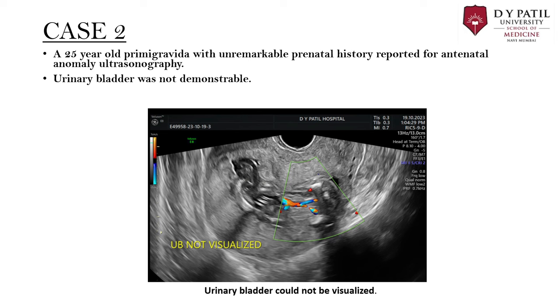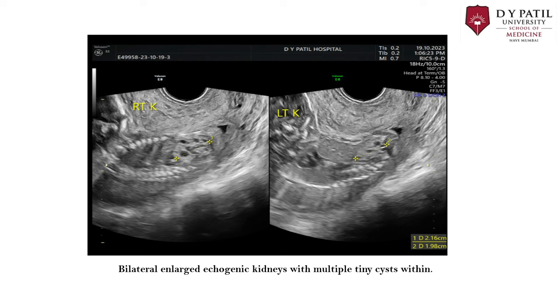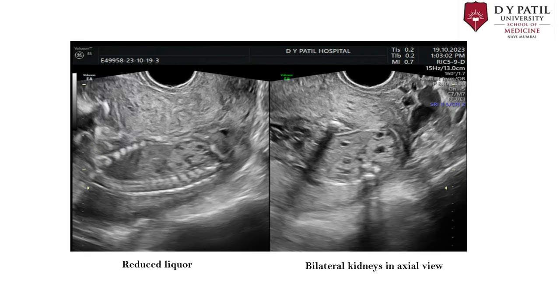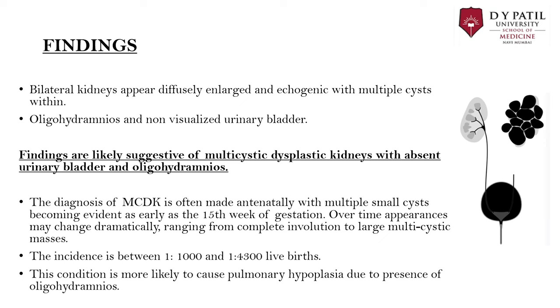In the second case, a 25-year-old primigravida with unremarkable prenatal history reported for an antenatal anomaly USG. The urinary bladder was not demonstrable. Bilateral enlarged kidneys with increased echogenicity compared to surrounding structures were seen, with multiple tiny anechoic cysts within. There is reduced liquor with hardly any amniotic fluid pocket visible. Findings are suggestive of multicystic dysplastic kidney with absent urinary bladder and oligohydramnios.